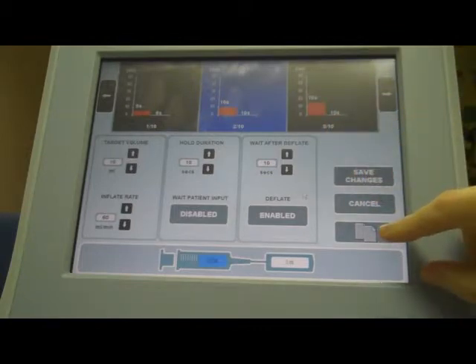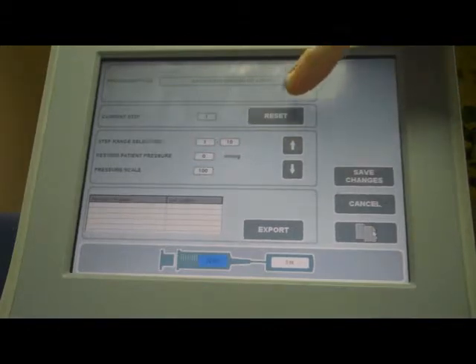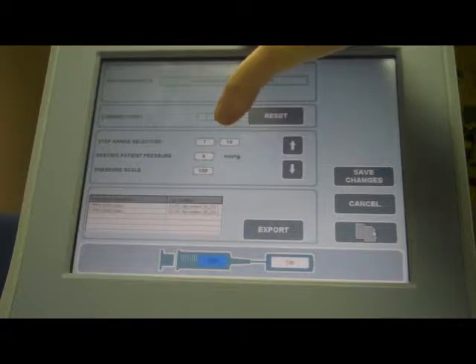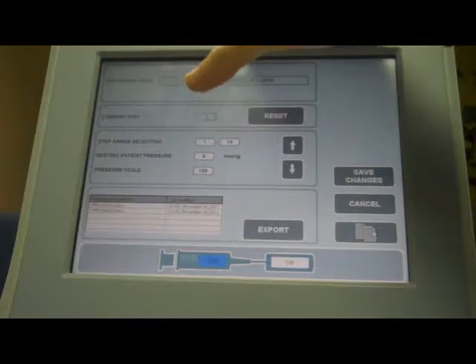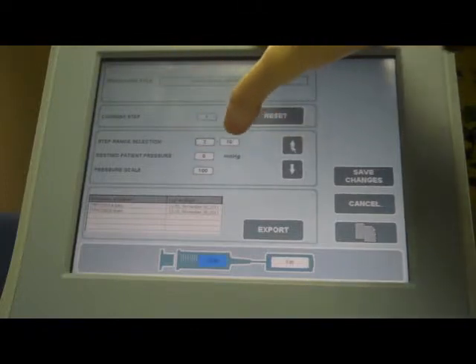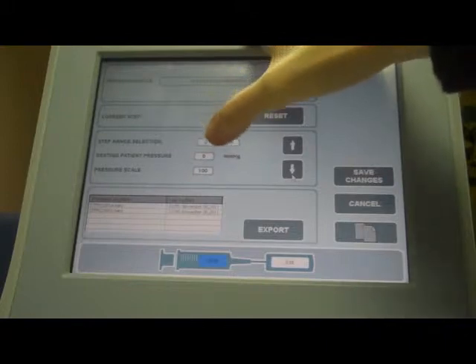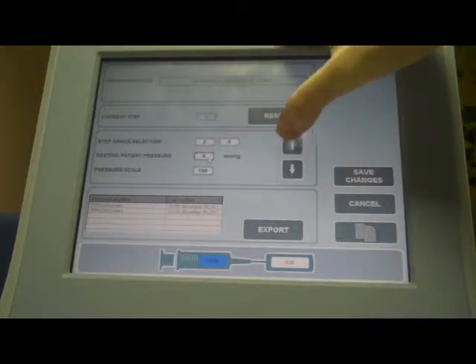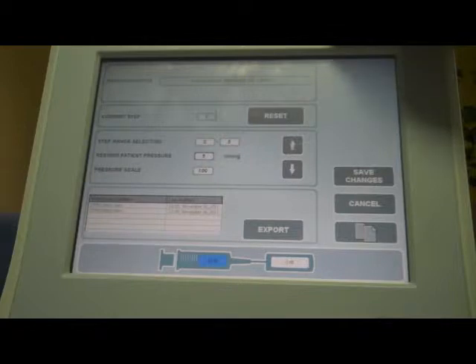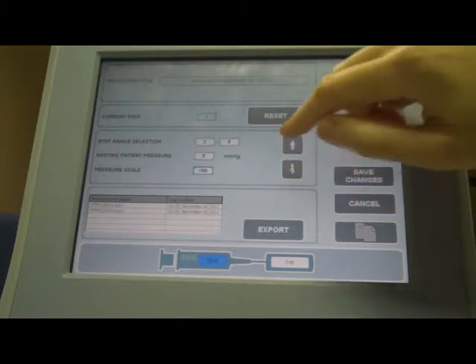Apart from the main settings screen, there's also another settings screen accessible by pressing this button. In this screen, it shows you the title of the procedure, the current step you're on, and gives you an option to reset the step back to the start. It also lets you select a range — so although you've configured steps 1 to 10, you might only want to execute steps 2 to 5. You can also enter the patient resting pressure. In the pressure scale setting, you decide the scale for the pressure graph — it can go to 50, 100, or 150. We'll set it at 100.